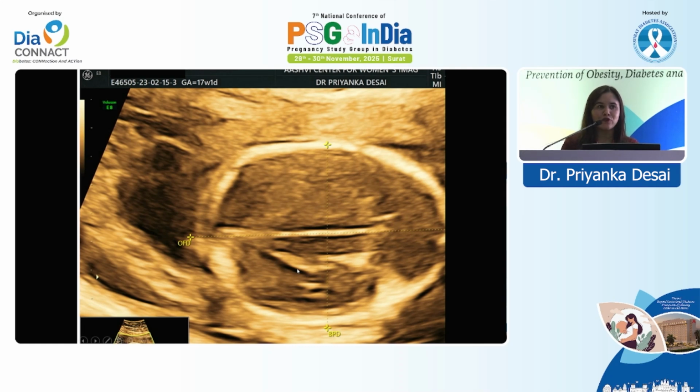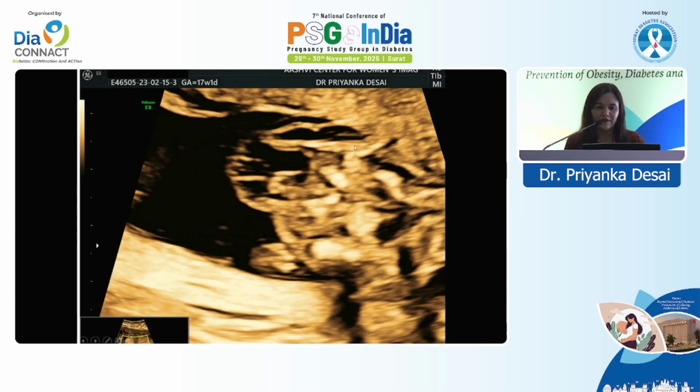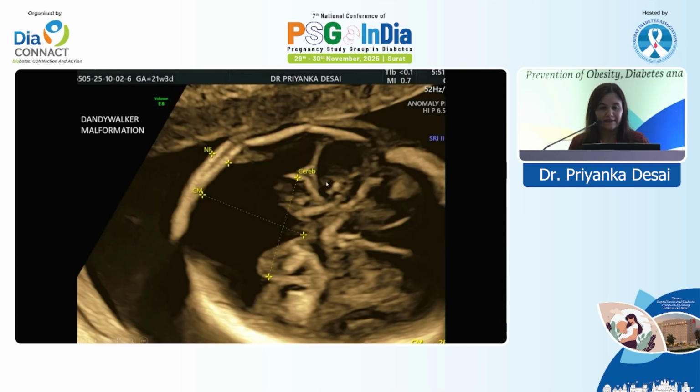So I'll just show you a few CNS cases. Now she is actually a case of type 1 diabetic. She came at 17 weeks, and this is the axial section of the fetal head. So we can see that there is scalloping of frontal bones over here. And when we looked at the spine, this is the lower portion of the spine. So this is a cystic mass which is seen at the lumbosacral region. So this is a sacral meningocele. This is another image of the same, which is showing a lumbosacral meningocele.